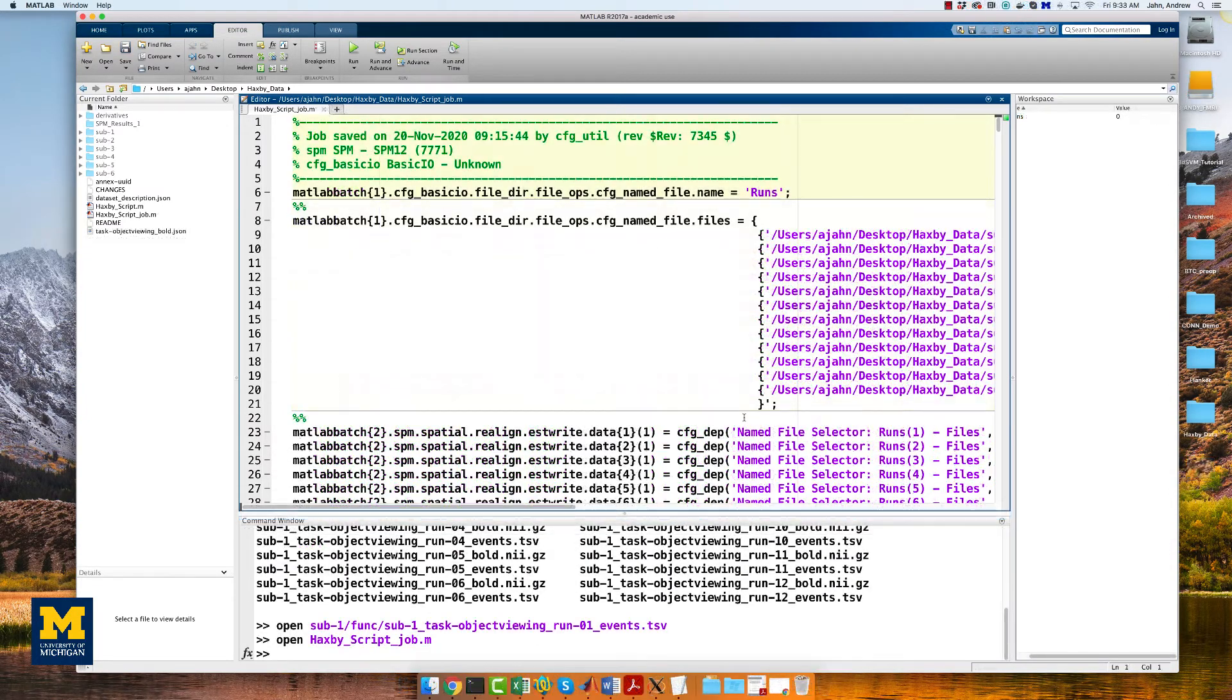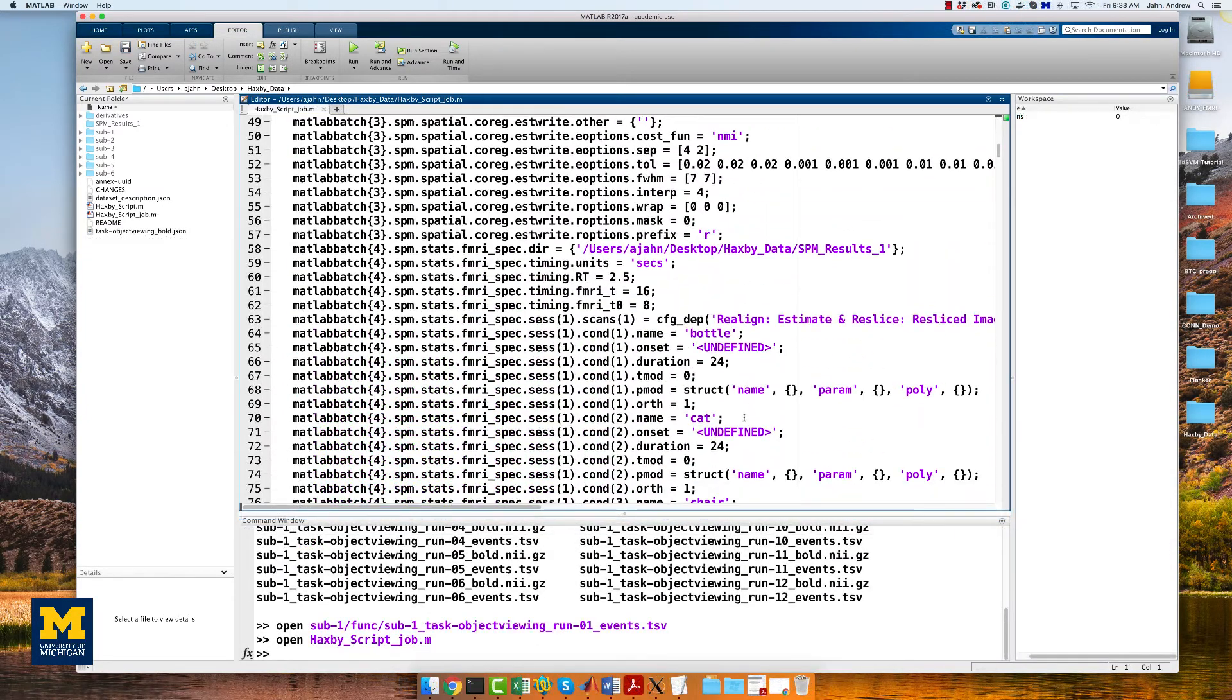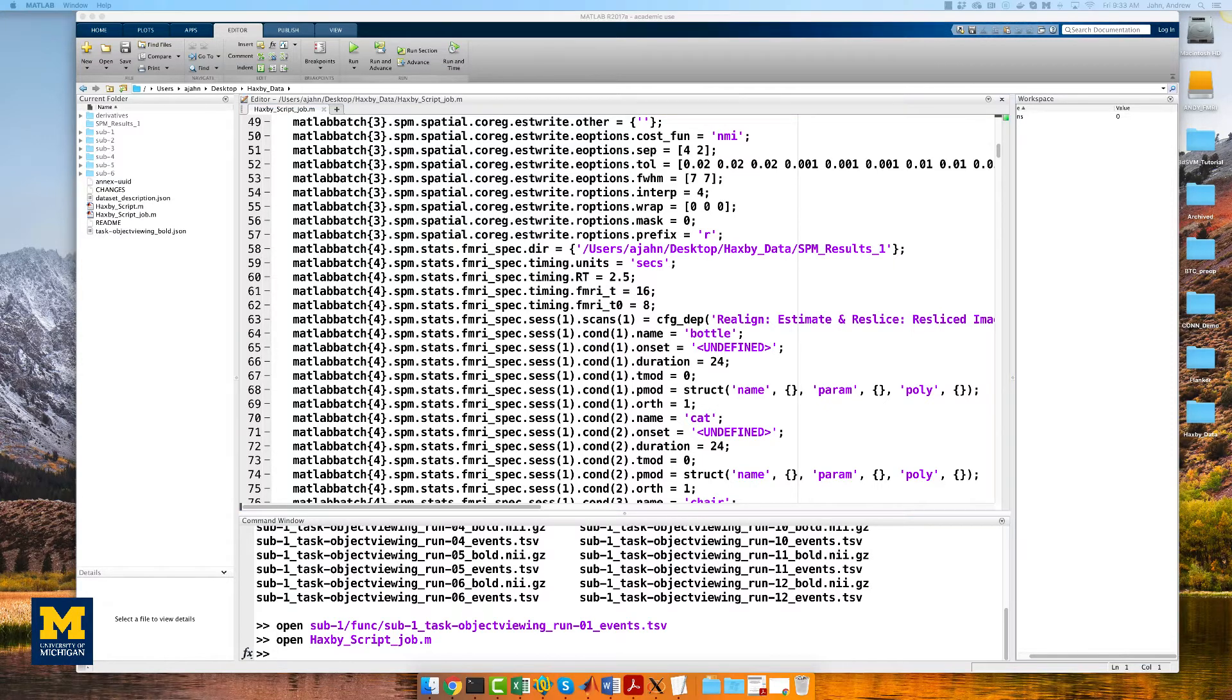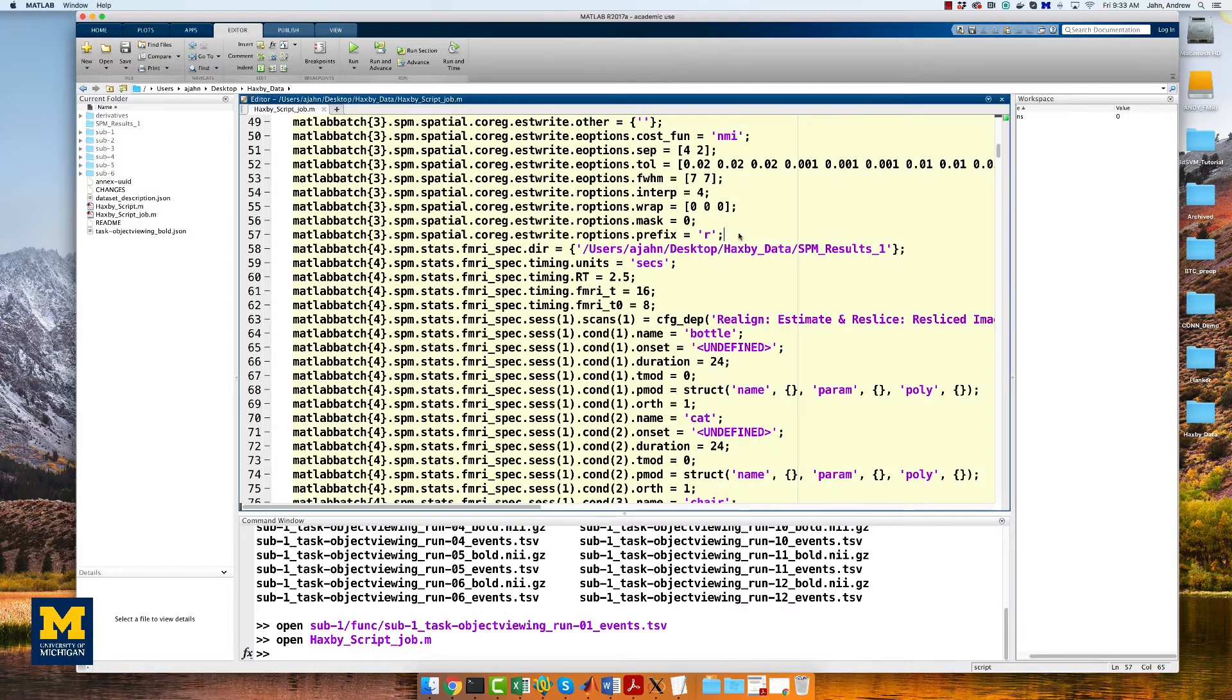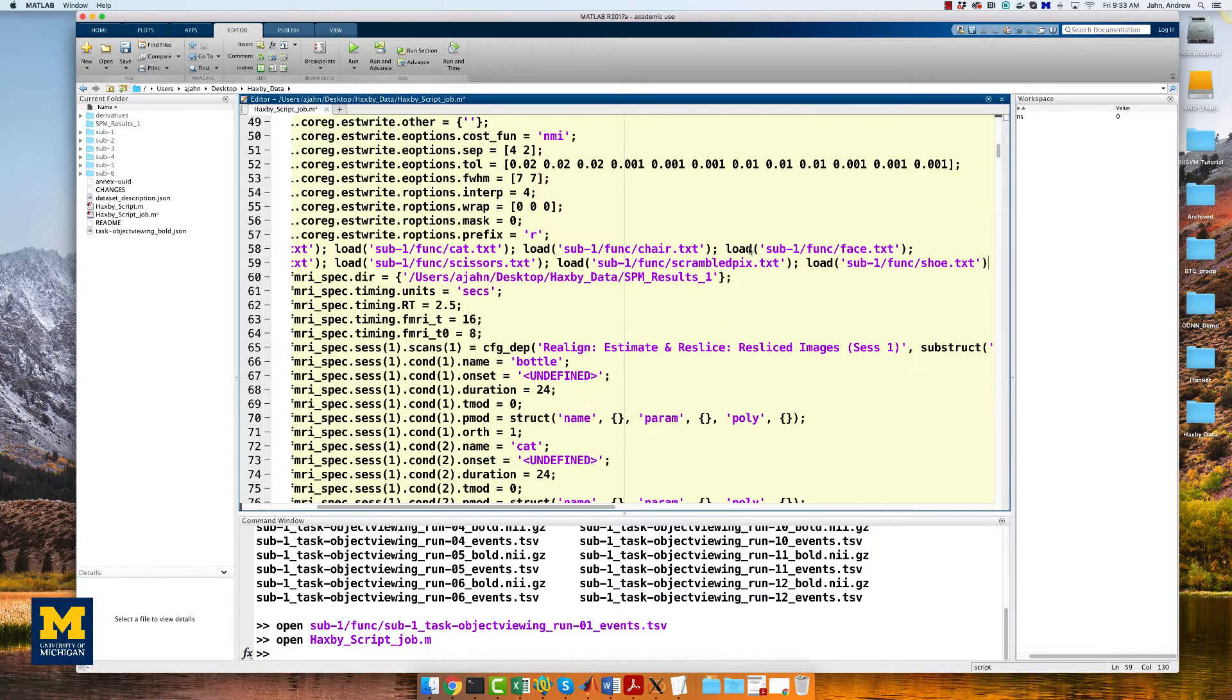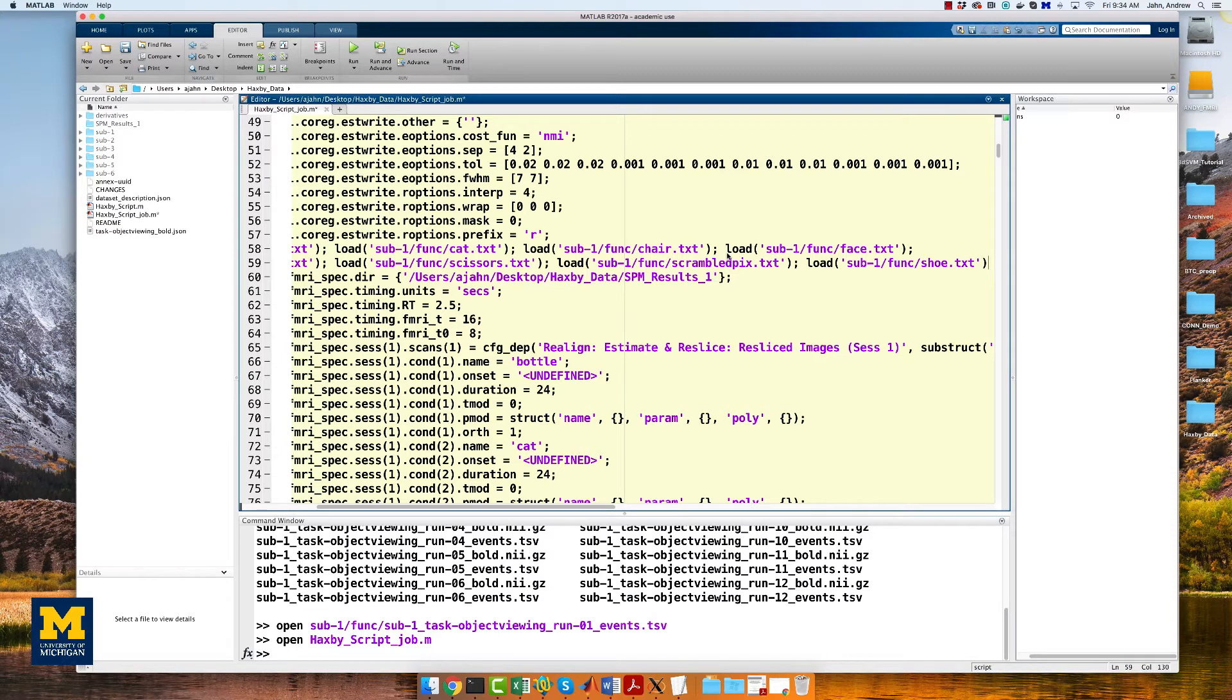Around line 58 is where the FMRI specification module is. Before the onset times are defined, enter the following code. I'm going to enter mine just after line 57. You can copy and paste this code from the more info box down below. What this code does is load each text file for sub1 into a variable. In this case, the variables will be labeled bottle, cat, and so on, corresponding to its timing file.